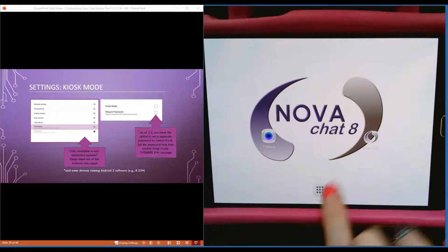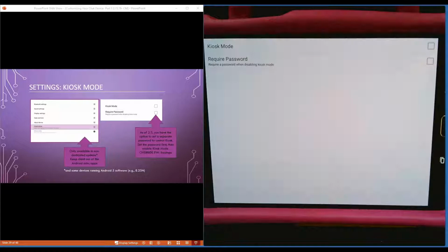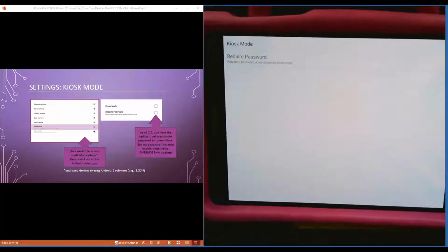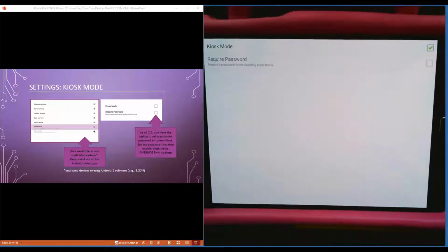Then you go back into your software, you turn your kiosk back on, and then as long as you don't change your router or your password or anything else like that, you will not have to mess around with kiosk mode anymore. So like if you're unlocking that menu, nothing has changed. We don't need to unlock kiosk mode. And when we're in kiosk mode, no matter how many times I push that button, I am locked into my device as being used as a communication device only.